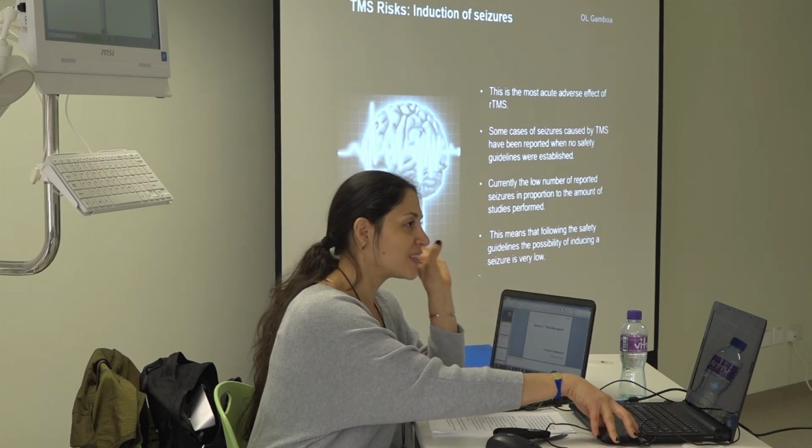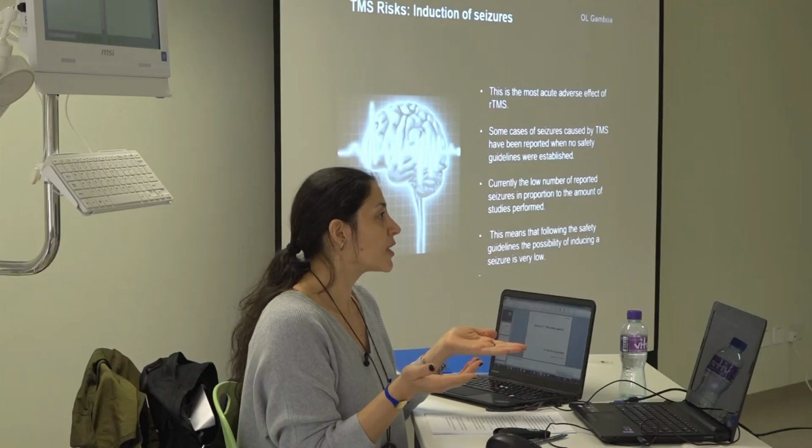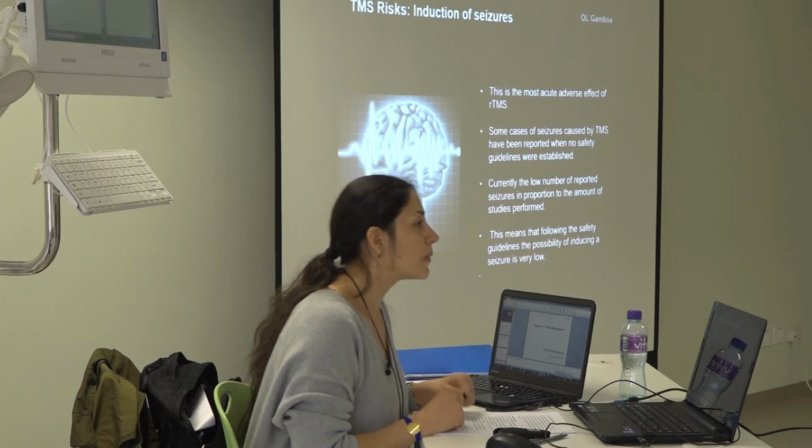If you are working with patients, you have to have a doctor. That is imperative. The doctor should be available. If you are working with a patient population, it is a matter of responsibility. You cannot just have a doctor half an hour from the place where you are. No, they should be available, okay? So, following the guidelines, the possibility of inducing a seizure is very, very low.